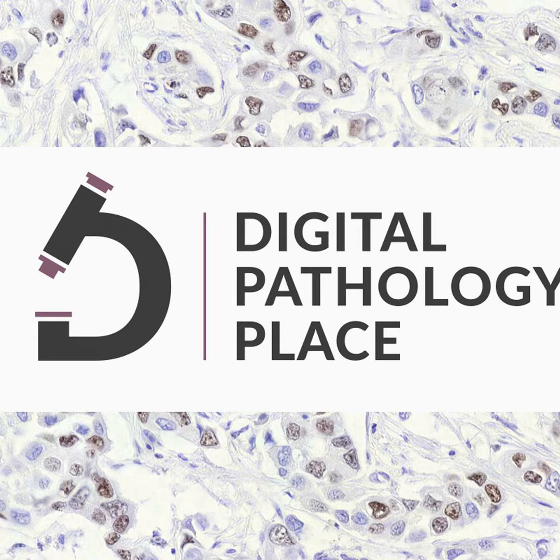But they had over 12,000, from 5 institutions, and then they included stain normalization and patch extraction techniques and did cross-validation against expert-annotated labels. And they had different models, and the one that was the best was EfficientNet B6. And when I looked at the metrics, okay, accuracy 0.913.